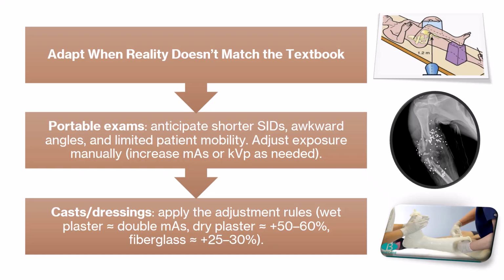What we're talking about is portable exams. Anticipate shorter SIDs, awkward angles, and limited patient mobility. So you'll need to adjust exposures manually.